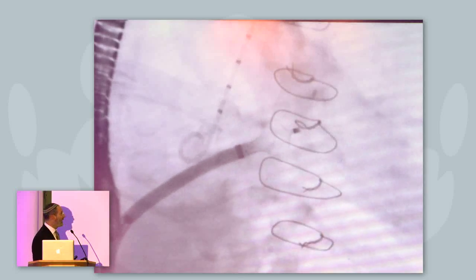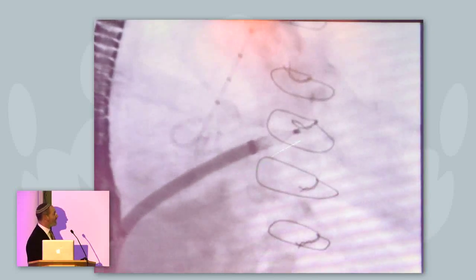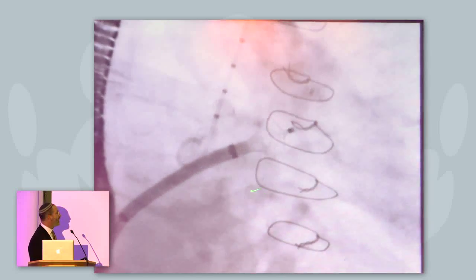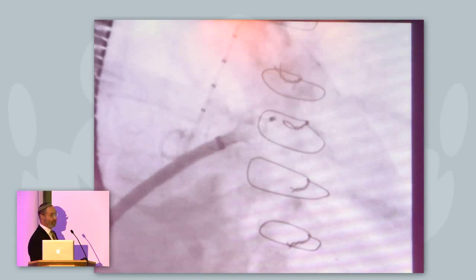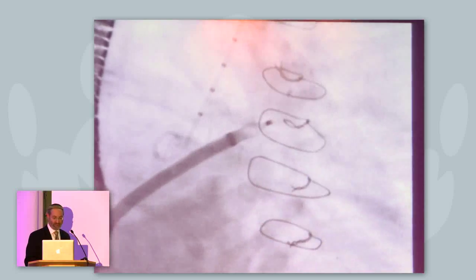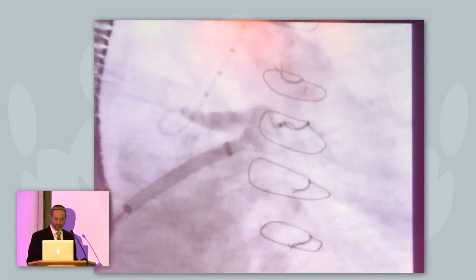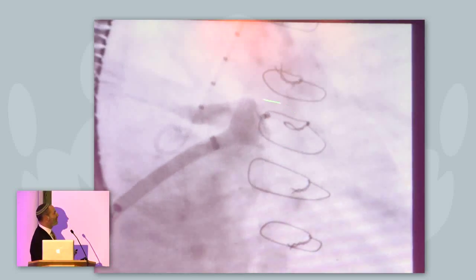And so here I am, and I'm actually putting my ball out. Now I'm unsheathing, as I described before, first step, unsheath. As you can see, if you remember, my neck is here, my body is here, and I'm certainly in the wrong direction, and I've no longer got a ball because it's an Amulet, so what I've actually got is a mushroom. So we're in a chicken wing sandwich with mushrooms at this point, and we can see here that it's sitting completely in the wrong orientation.